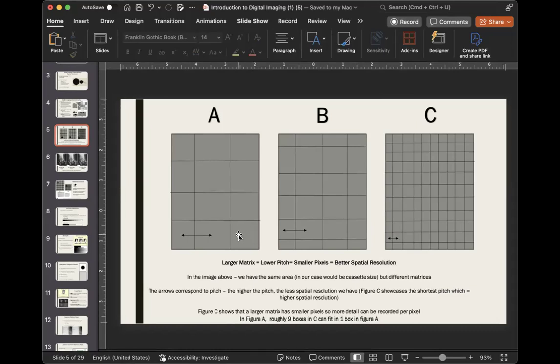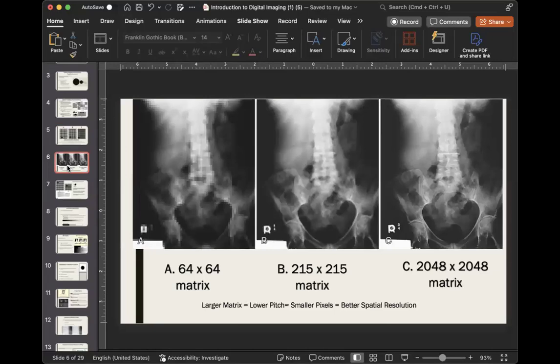So everything becomes less sharp because when we look at it, what we're seeing is that we wouldn't be able to distinguish all 9 of these blocks, right? We would only see one block that's an average of all the shades. And how that looks when an image presents itself is here. So look at this matrix with 2000 by 2000 amount, right? And then here is a 64 by 64.